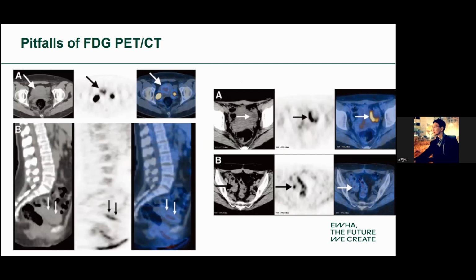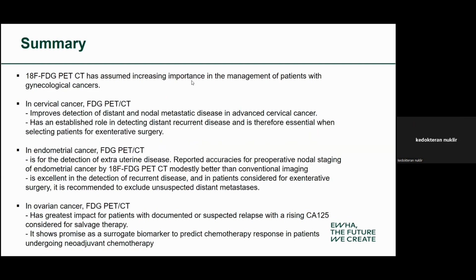Would there be any other questions or comments? Thank you, Dr. Su. Thank you, Dr. Kang, for your nice presentation. I would like to ask about adenomyosis. Is there any clue how you differentiate between adenomyosis and uterine sarcoma or uterine malignancy?